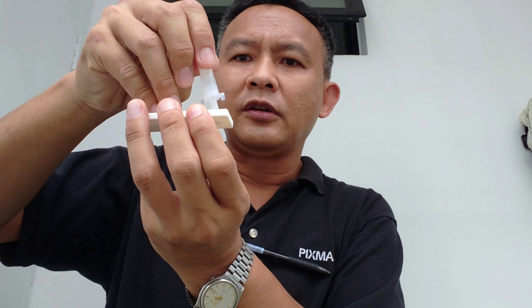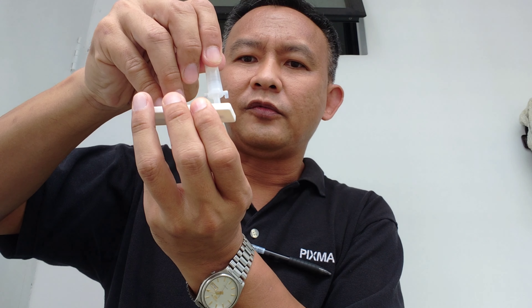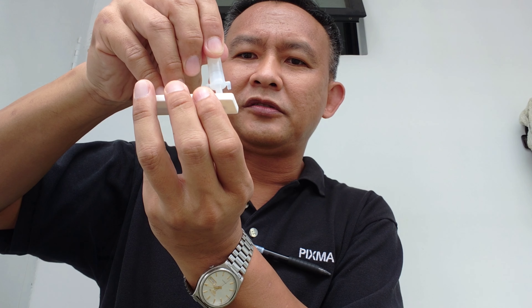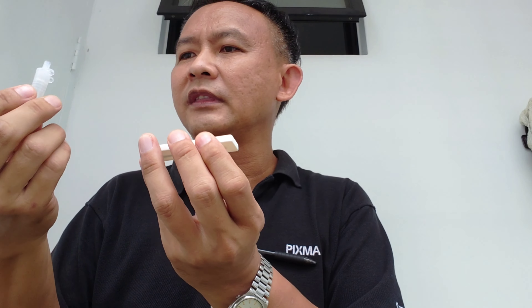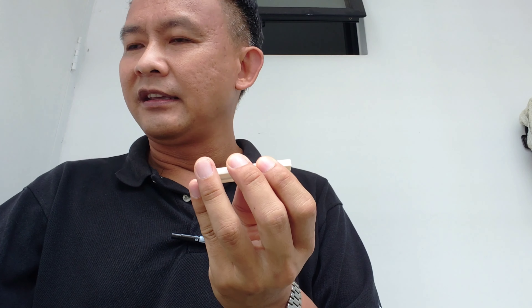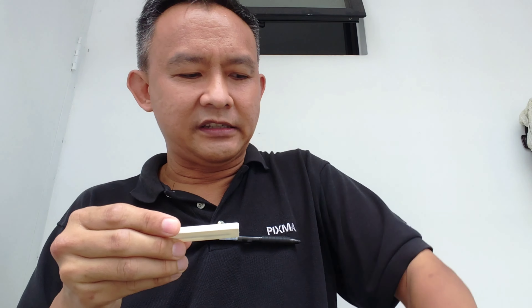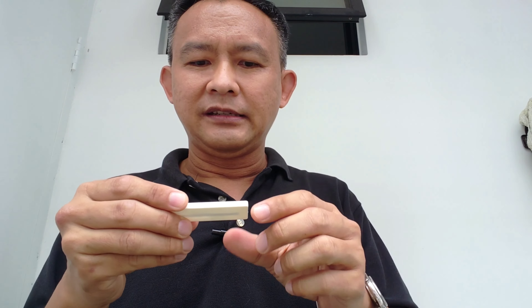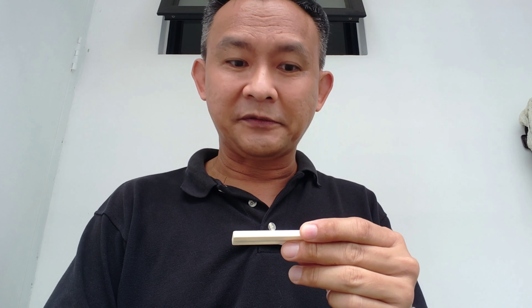Let's get two drops — one, two. Okay, done! Step four: you have to wait for 15 minutes. Now it's 1:10, so wait for another 15 minutes.